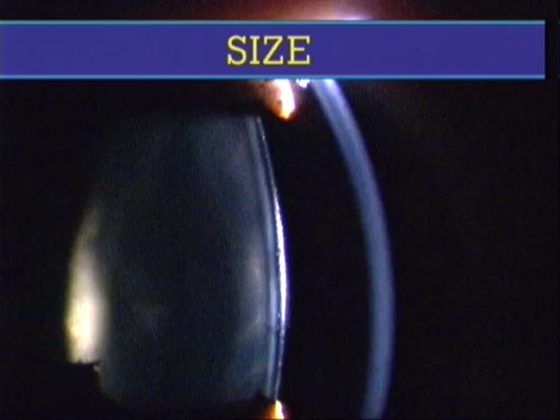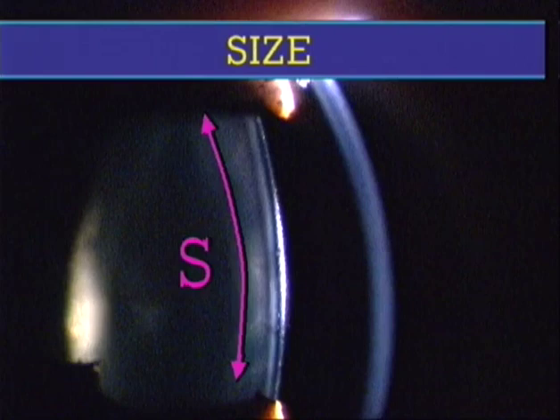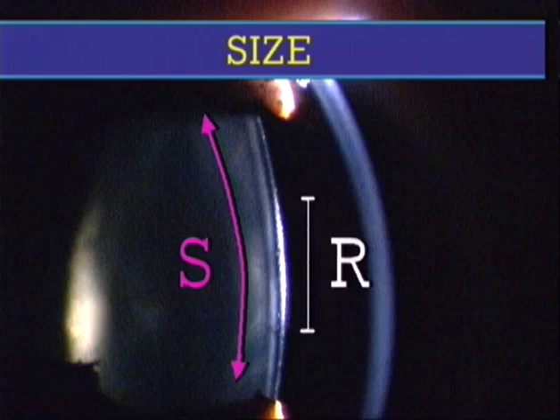One difference is the size of the generated optical phenomenon. Here, within the lens, the effects of scattered light are as large as the illuminating beam. In contrast, the specular reflexes at the capsule are much smaller, depending, as explained earlier, on the curvature of the reflecting surfaces.